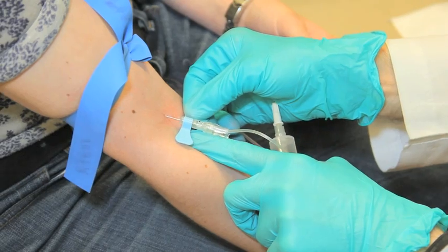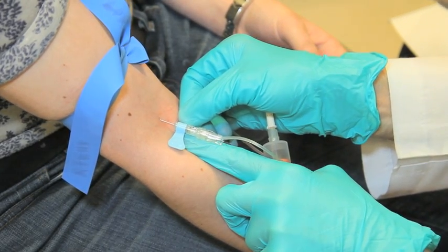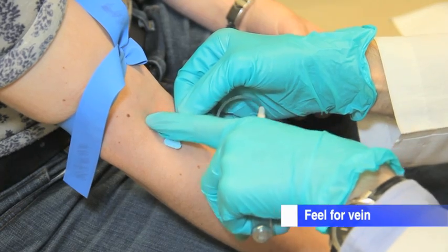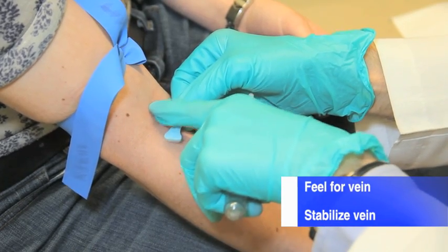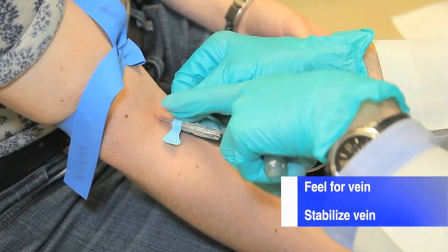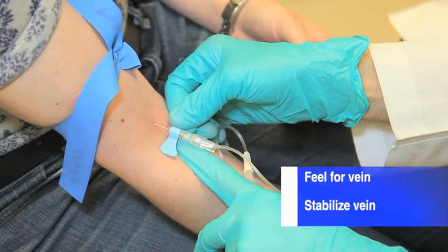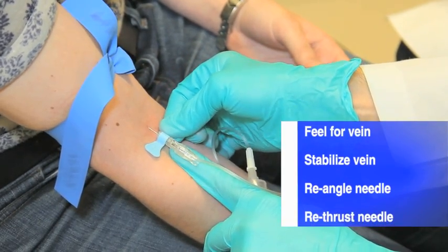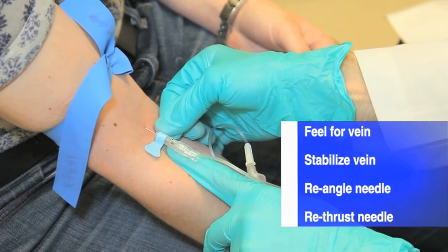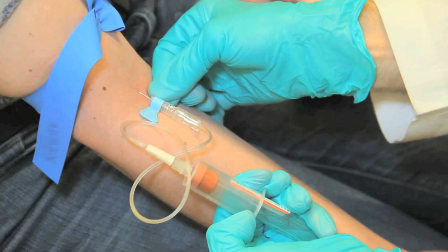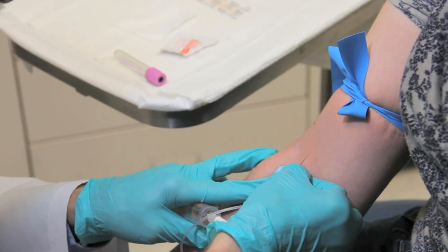If you don't see a flash of blood, do not panic or withdraw the needle. Keep the needle in the patient's arm and feel on either side by applying gentle downward pressure and release of the target area using the left index finger tip. Usually the vein is just next to the needle. Redirect the needle at 30 to 45 degrees towards the vein and make a quick thrusting motion in its direction while stabilizing it with traction with the left thumb or left index finger. A slow thrust will allow the vein to roll away.